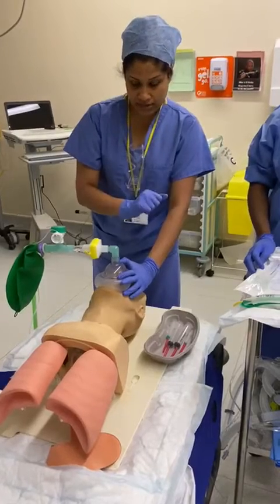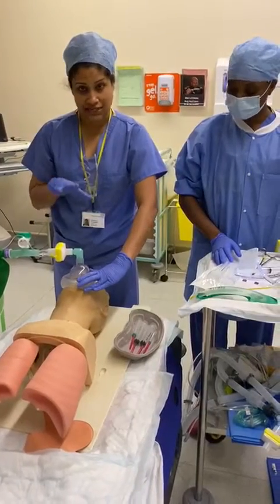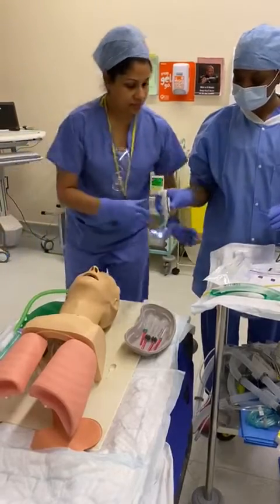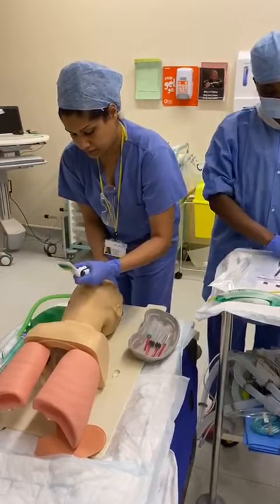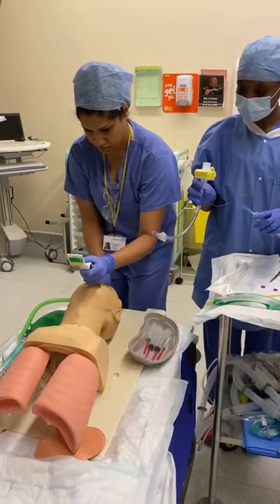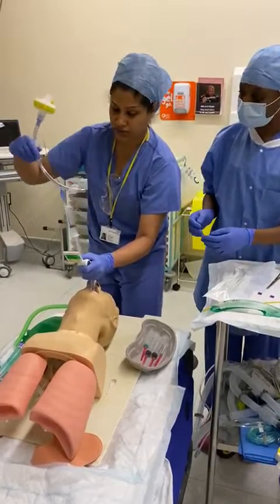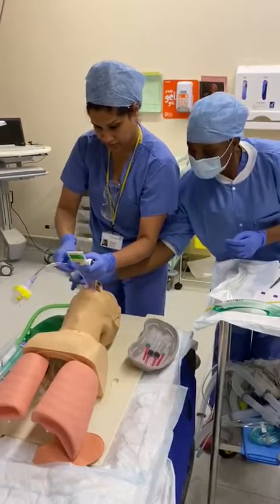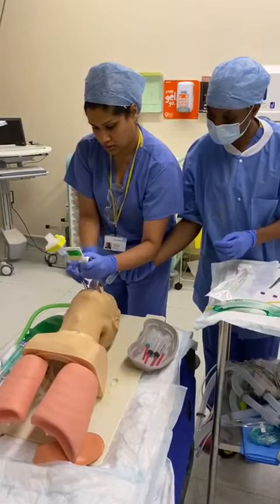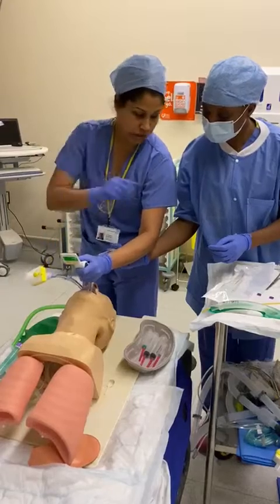If it's a cardiac arrest situation, you're going to get straight on to intubating. Allocate someone to give in the intubation drugs, wait the 45 seconds for the paralytic, the muscle relaxant, to work. Once that's happened, take the mask away, go in straight with the McGrath. Once you've got your view, take your tube with the filter already attached. Go in, and once you're in the right place, get your ODP to inflate the cuff.